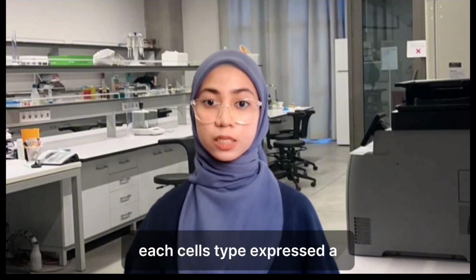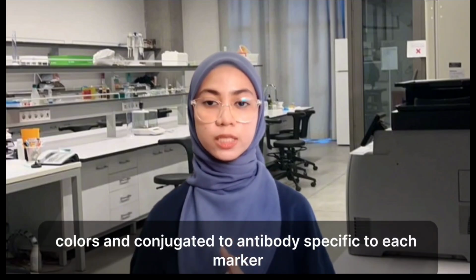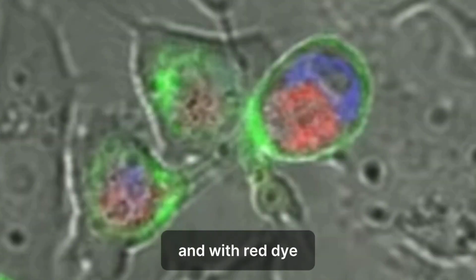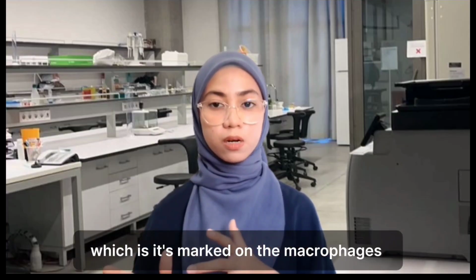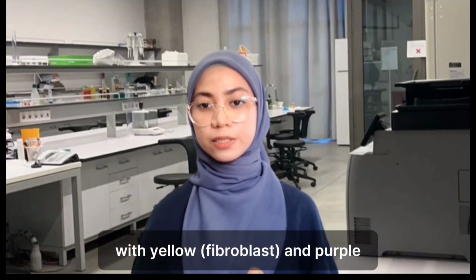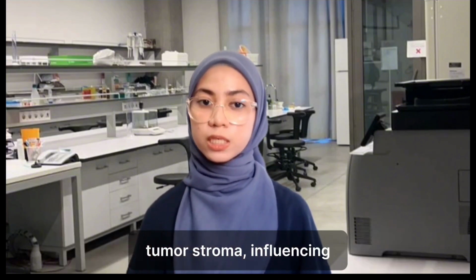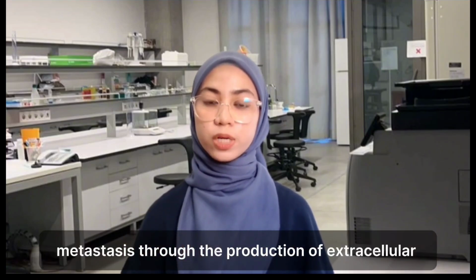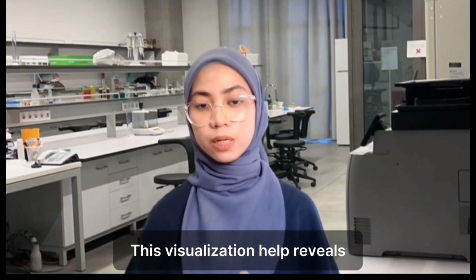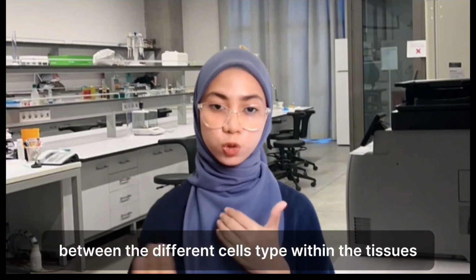Okay, each cell type expresses a unique set of proteins, and different fluorophores are selected based on their emission spectra and conjugated to antibodies specific to each marker. For example, overlapping green, which is the T cell, with red dye, which marks the macrophages, highlights areas of immune response, while yellow fibroblasts and purple collagen fibers might show how fibroblasts contribute to the tumor stroma, influencing tumor growth and metastasis through the production of extracellular matrix components. Okay, these visualizations help reveal complex interactions and spatial relationships between the different cell types within the tissues.